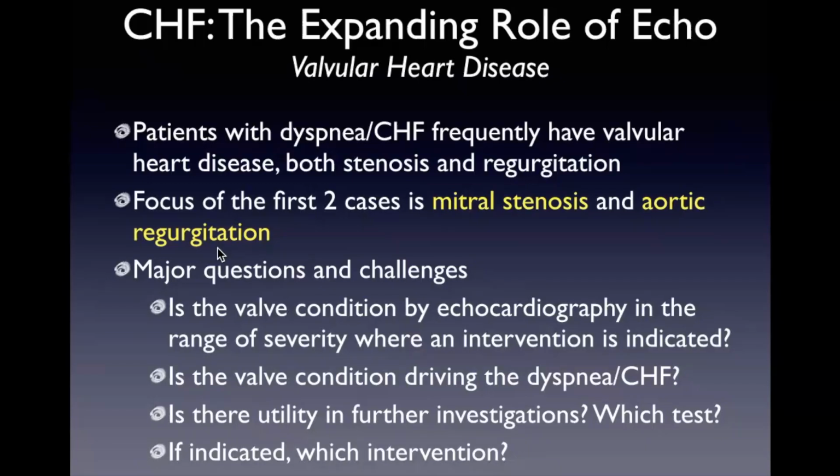And then is the valve condition driving the dyspnea or the heart failure? So a lot of patients complain of shortness of breath, but is the regurgitation or stenosis the driver of that shortness of breath? Do we need other investigations beyond echocardiography? Echo is not the only test that you get, although sometimes it's good enough. And then if so, which test? Then after that, is there enough evidence to support an intervention?